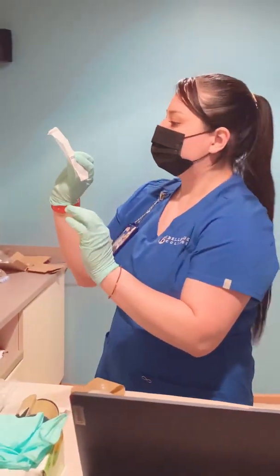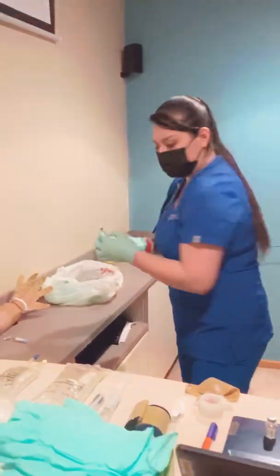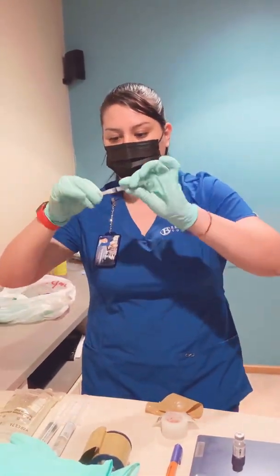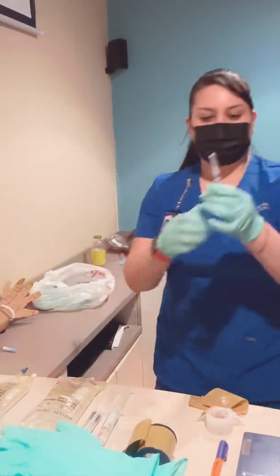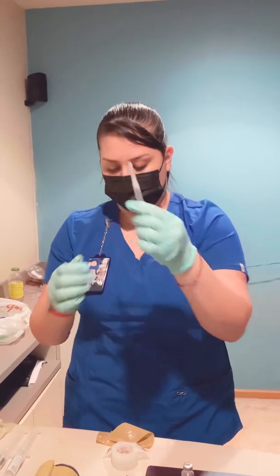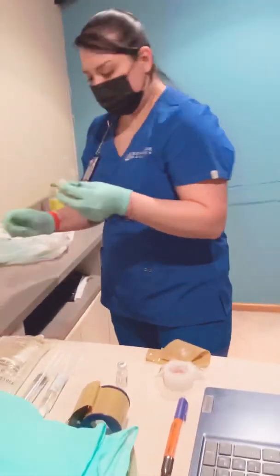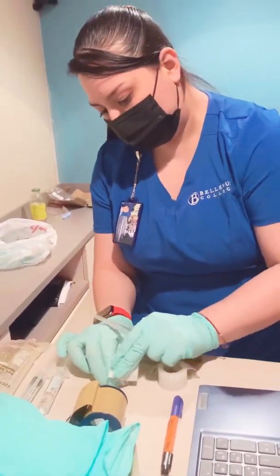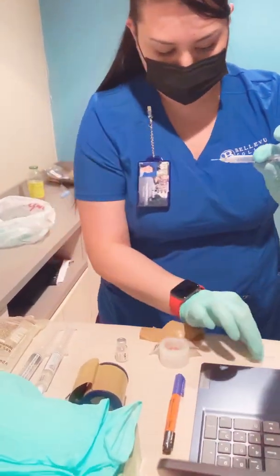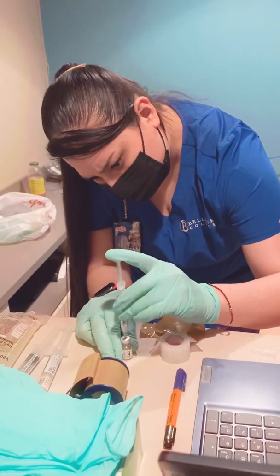I am using a 3 ml syringe. And I'm getting my needle here and doing a sterile technique. And I'm going to aspirate some air into the syringe. And I'm going to then swab my vial for 30 seconds with alcohol. Remove the cap.